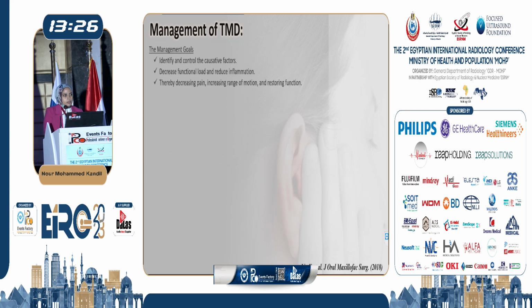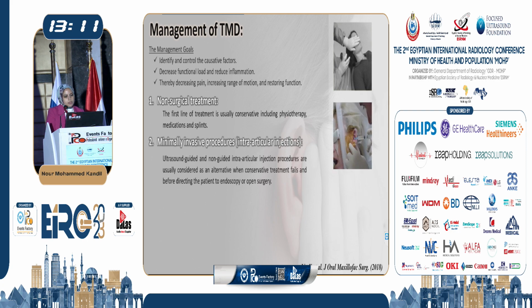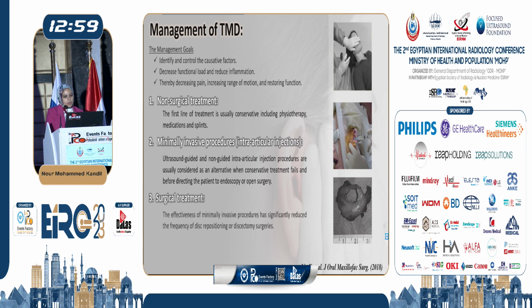The management goals are to identify and control the cause, decrease functional load and reduce inflammation, resulting in less pain, increasing range of motion, and restoring function. The first line of treatment is usually conservative, including physiotherapy, medications, and splints. Intra-articular injections could be ultrasound-guided or non-guided. They are usually considered as an alternative when conservative treatment fails and before directing the patient to endoscopy or open surgery. The last option could be surgical. The effectiveness of minimally invasive procedures has significantly reduced the frequency of disc repositioning or discectomy surgeries.